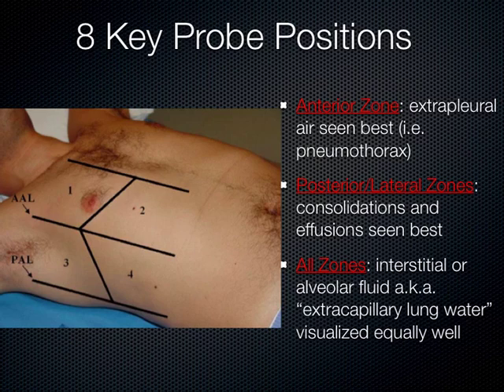This patient is lying down. Most of the patients you'll see in the hospital that we ultrasound are lying down, although it is possible to image the back. And what we're teaching you today is primarily we focus on the anterior, because there's gravity, and essentially if you're on your back for any length of time, any kind of fluid in your lungs will go to the back and you'll get false positives. So we really want to image the front and the sides to tell us what is going on in the lung. Anteriorly is the best place to look for pneumothorax, and we'll talk about that in a few minutes. But if you think about it, if you're supine and you have air that has escaped from inside the lung into the pleural space, where is it going to be if you're on your back?